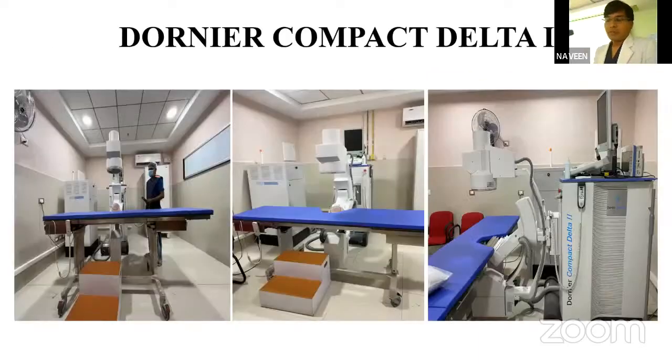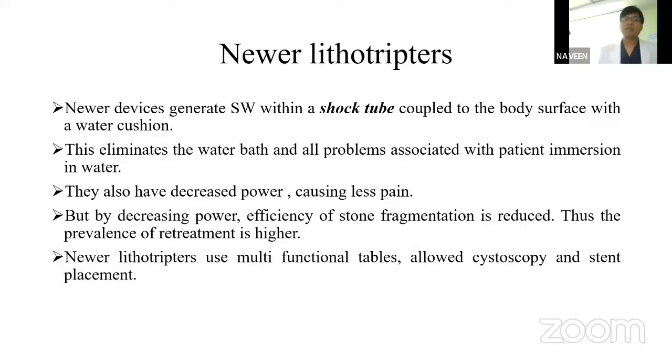So in our medical college, we have the Dornier Compact Delta 2 type of system. It is an integrated type of system, and it is based on an electromagnetic type of generator. With the newer lithotripters, they generate the shock wave outside the body in a shock tube, and they also eliminate the water bath, and they have decreased power and cause less pain. Because of the decreased power, the stone fragmentation is also reduced. So the retreatment rate is very high with the newer lithotripters.